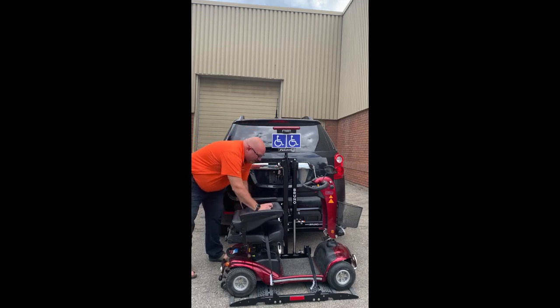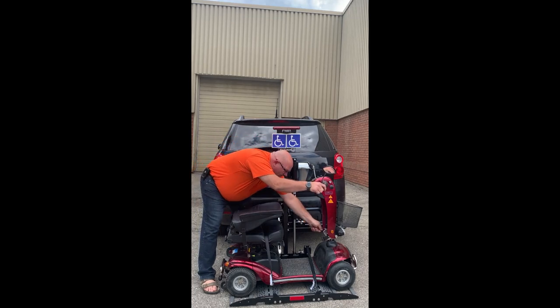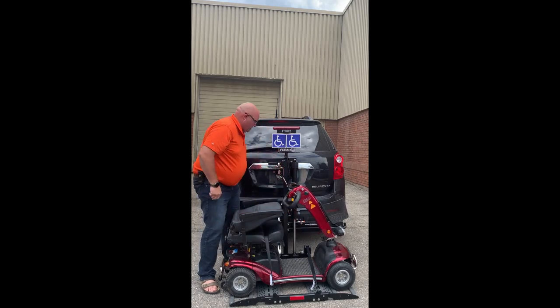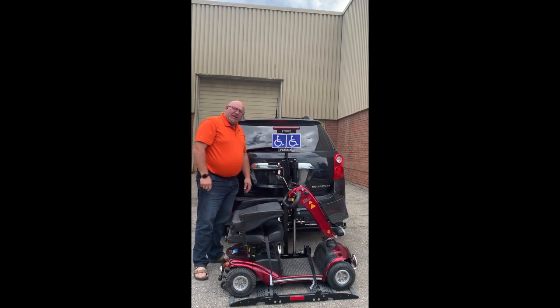I'll fold the backrest down. I will also fold the tiller head down some. Now the unit's ready to be lifted.